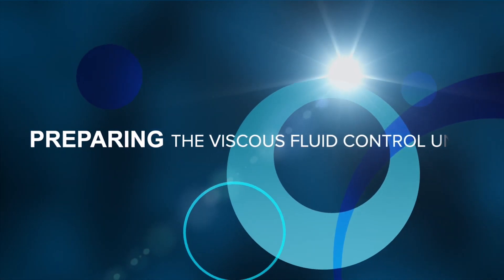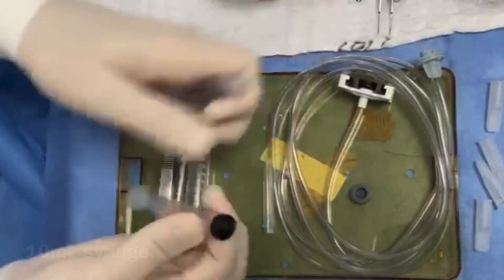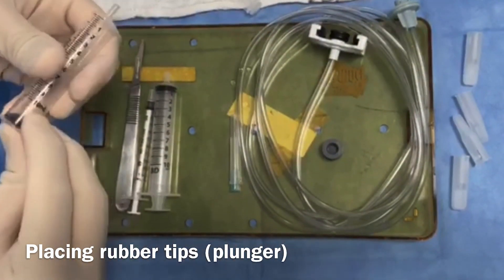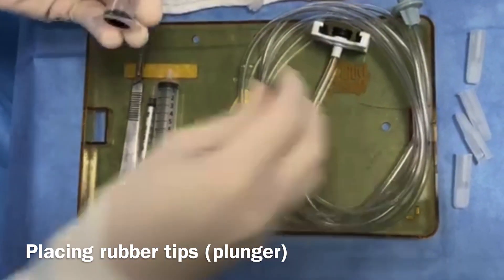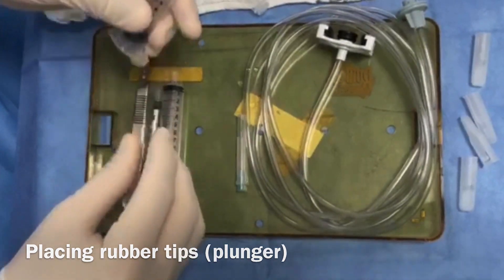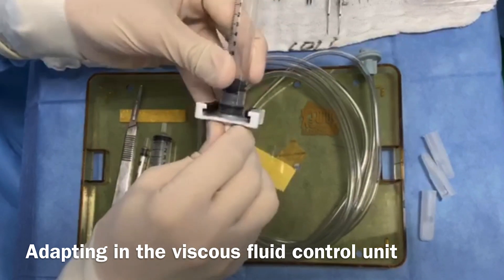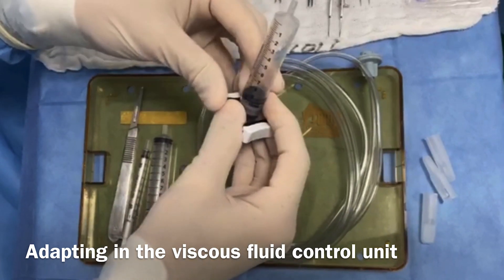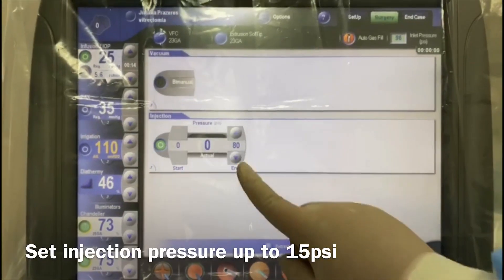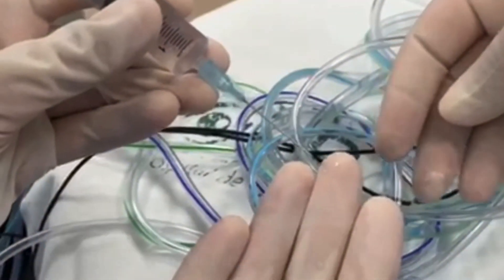Here we show the preparation of the fluid control unit with a 10-milliliter syringe. Before you inject BSS into the subretinal space, you can reduce the intraocular pressure infusion. Before the injection, it is important to set the pressure up to 15 psi and to test the system.